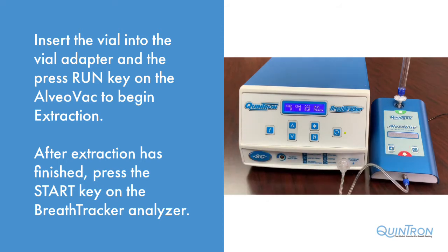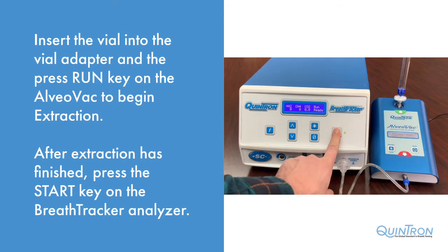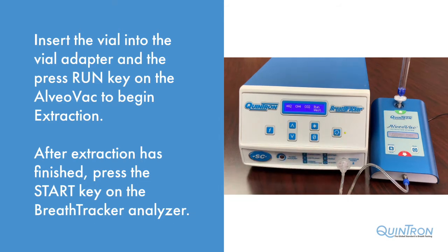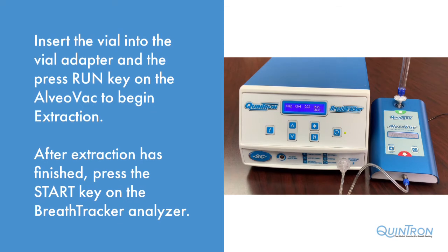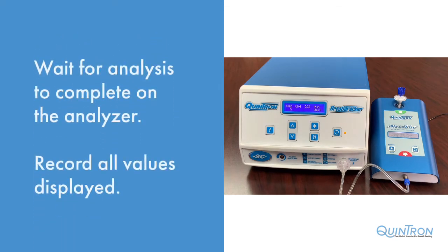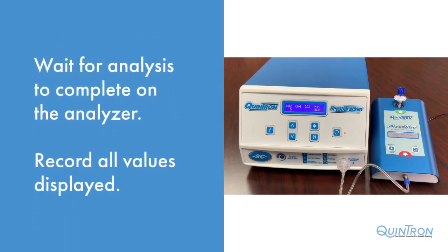After extraction has finished, press the Start key on the Breath Tracker to begin analysis. Wait for the analysis to complete on the analyzer. After analysis is complete, record all the values displayed.